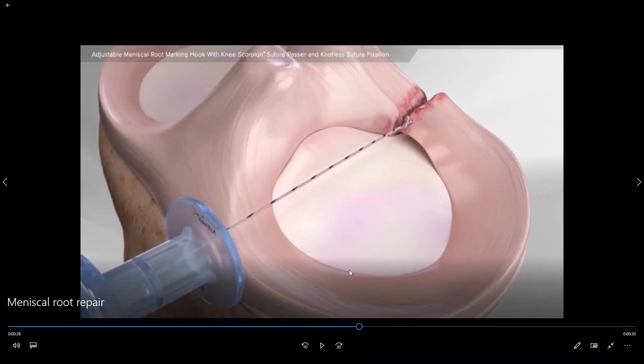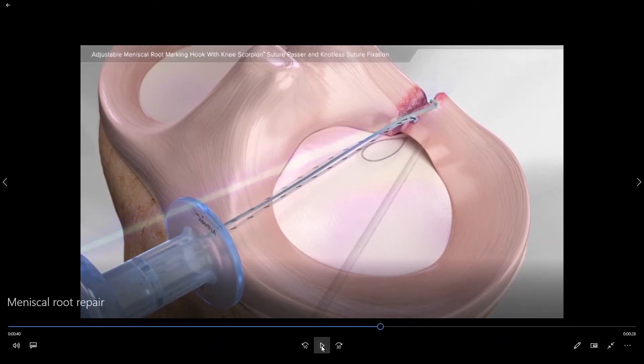We will do that by placing two stitches into the end of the torn meniscus. We will then drill a small hole up through the bone from the front of the tibia. The hole will be used to pass a suture shuttling device up through the bone that will then be used to pass these sutures down and through the drill hole.